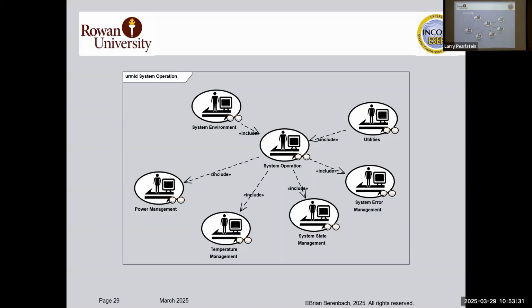And so the utilities are very important too, because you have to plug it into the wall. You have to do hookups of water. What are you going to do about waste? You have to have facilities for removing the waste. So these are all things that a systems engineer would consider, as opposed to a programmer or a software engineer who might think about the software side of these, but wouldn't think about the mechanical side or the electrical side.